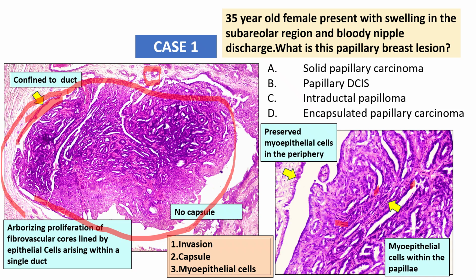So what will be your diagnosis? It is a case of intraductal papilloma. Why is it not solid papillary carcinoma?